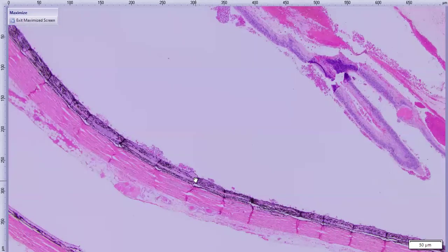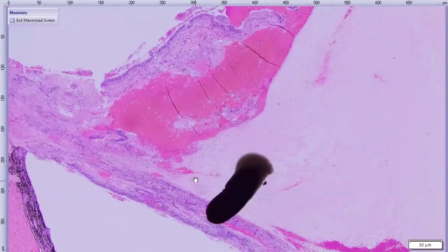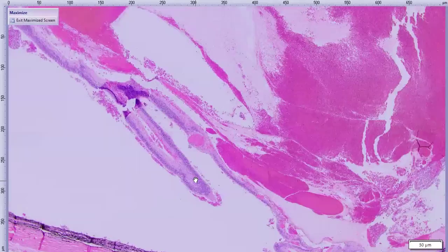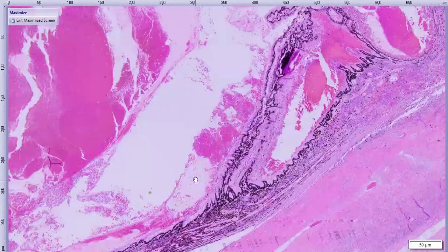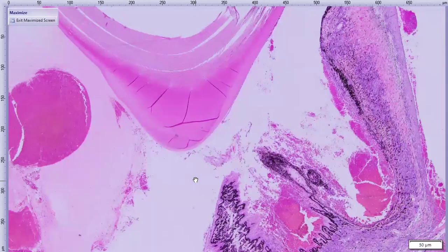That was negative. So I released a report that was, I don't know how helpful it was, just providing some vague differentials saying, hey, maybe consider testing for systemic infectious disease. There is retinal detachment and hemorrhage, rule out systemic hypertension, but this is overall just kind of a vague inflammatory lesion. And it's hard to say why it's there. So I ended up getting deeper sections, which isn't usually very fruitful. But in this case, it was, which is why I'm showing this case.